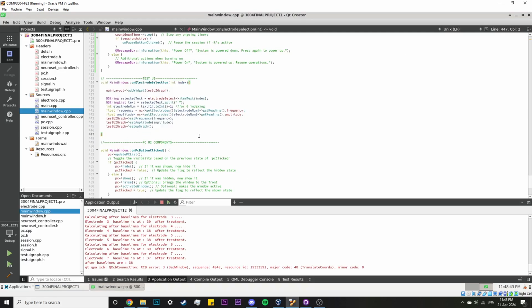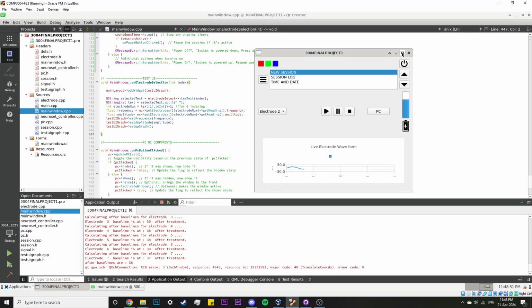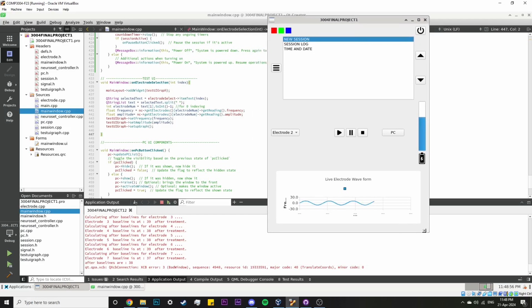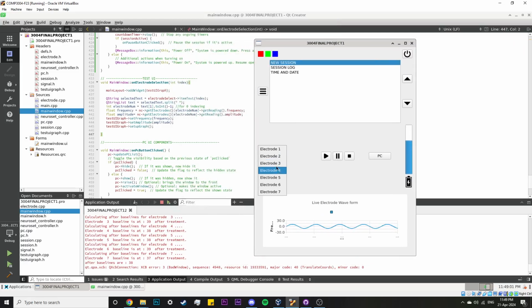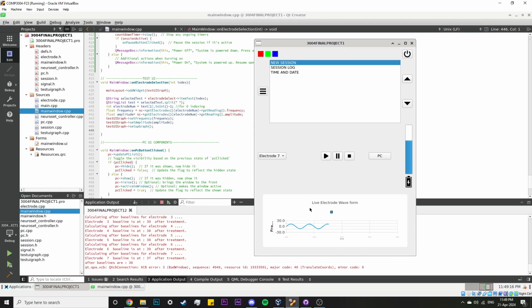Basically, the test UI segment, all it's really doing is this. If you can pull the main window up real quick, if you look at the drop-down menu here, you see there's a drop-down list with text on it. It just parses that to find the number of the electrode you're currently trying to select, and then it references that electrode in the electrode list that is in the instance of the neural controller that's in main window, and all it does is get the amplitude and frequency. It puts it into a sinusoidal wave function, and then that's put on main window, and that you can see is different for all the electrodes.